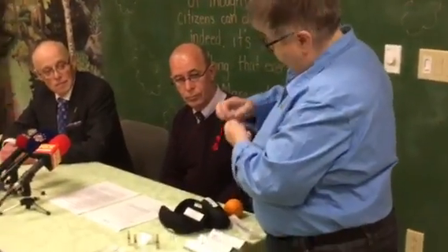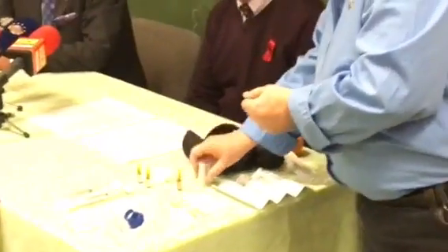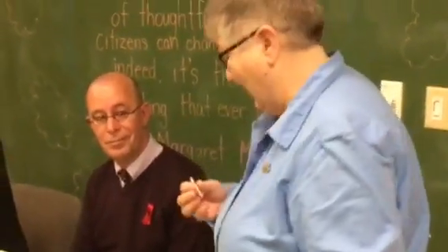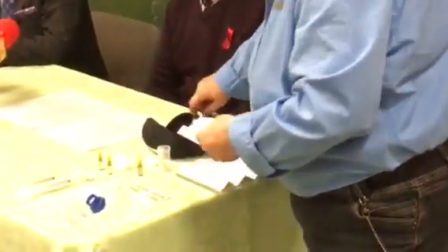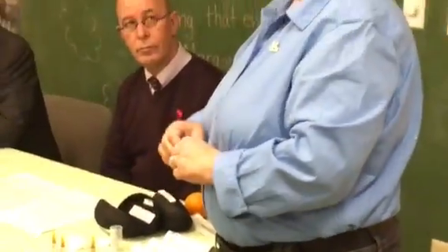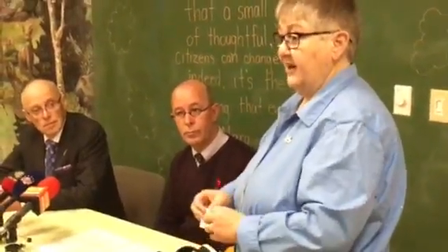It's naloxone. This one is water, so we don't waste any naloxone training people. There's a little card inside. As you can see, these kits are numbered. So we're going to trace these kits and see where they were used, to try to see how they were used, so we can continue to build on best ideas from the people who use it, what works best. So it'll be evolving so that it better meets the needs of the individuals.